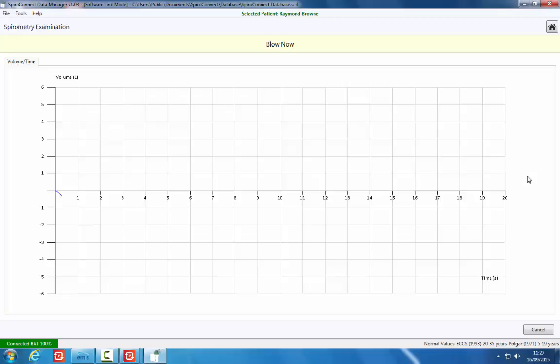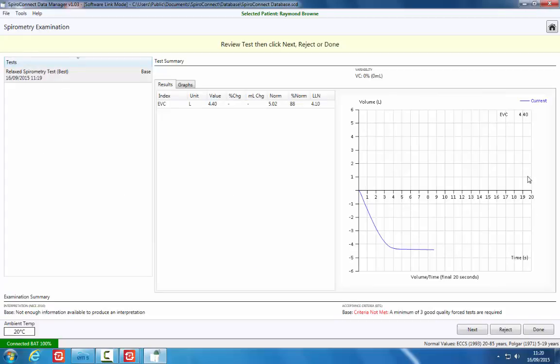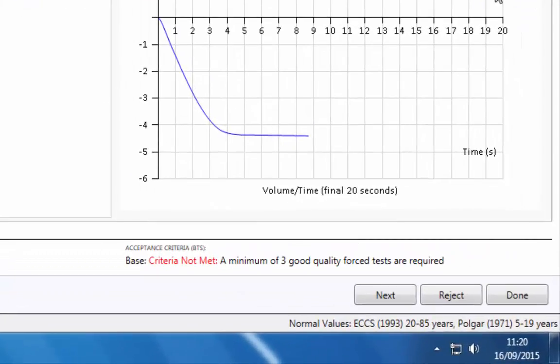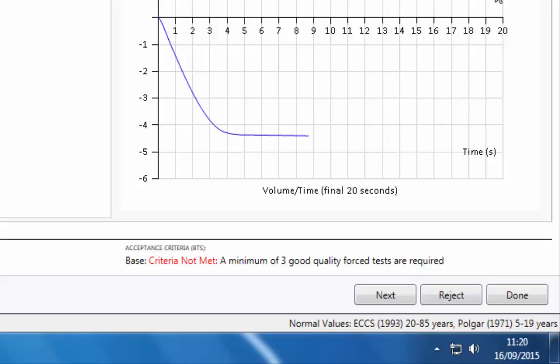As the patient performs the blow, the live volume time curve will be displayed. At the end of the maneuver, the test summary screen will be shown. If the blow was not acceptable, click the Reject button. This will discard only the most recent blow; previous blows will be retained.